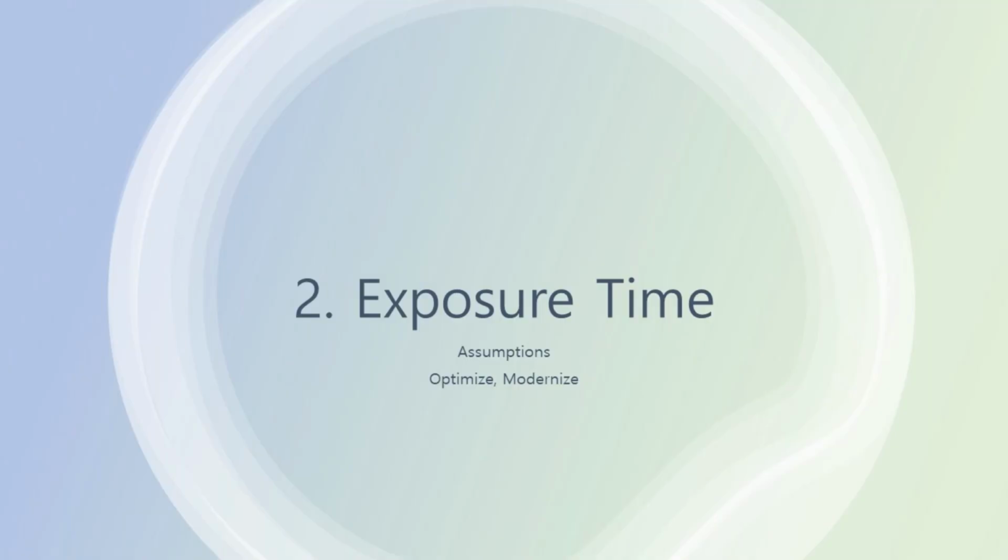Delving further into the 3D printing process, let's explore the crucial role of exposure time, especially in the context of dental crown fabrication. Exposure time is all about the duration for which the resin is exposed to light, a key factor in determining the resin's curing speed and depth. The selection of the right exposure time is critical for the final product's strength and durability.